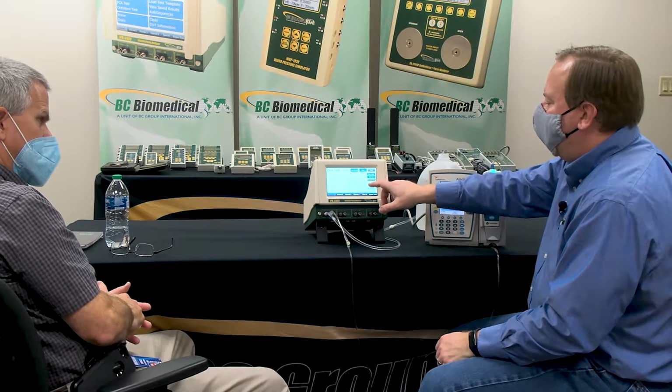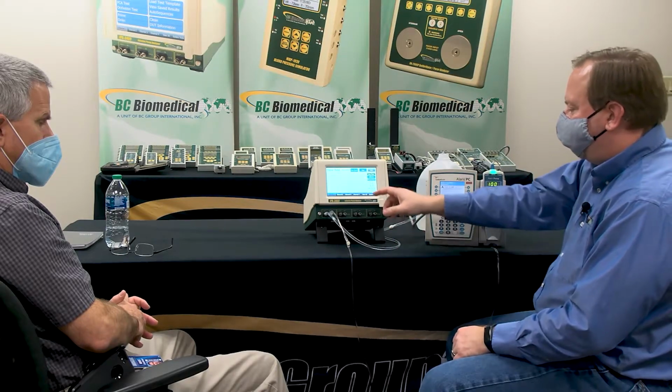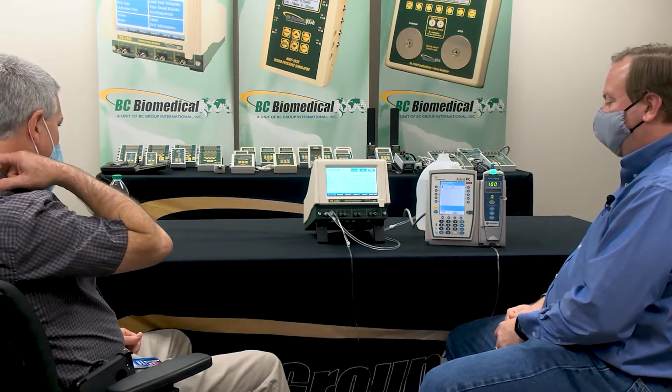So here's our percentage. We can show the volume, how much volume has been delivered, or our flow rate, and we get our bars up here. This is our tolerance, whatever we programmed in for our plus or minus 10%, and that's what it's showing there. Or we can hide the graph and see our actual data. So our average is a little bit low. And again, this could be a 10% device, could be 20, kind of scary sometimes, but how wide the tolerance is on the.